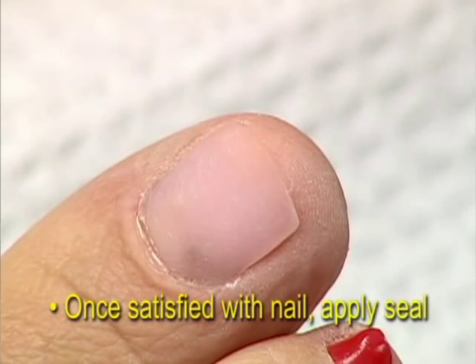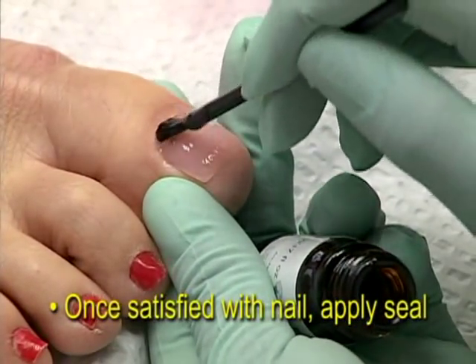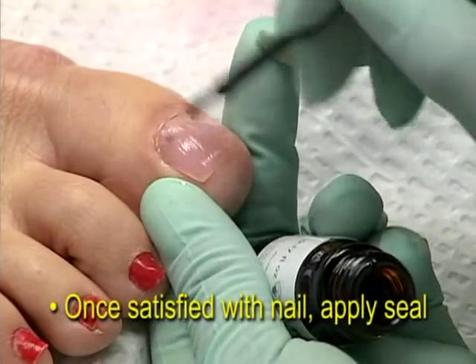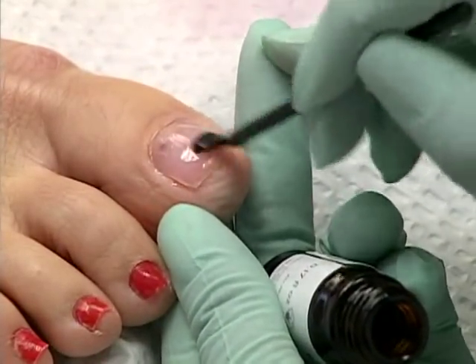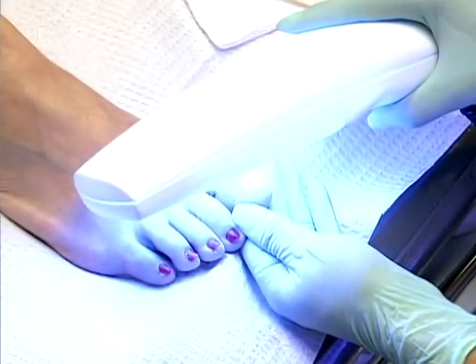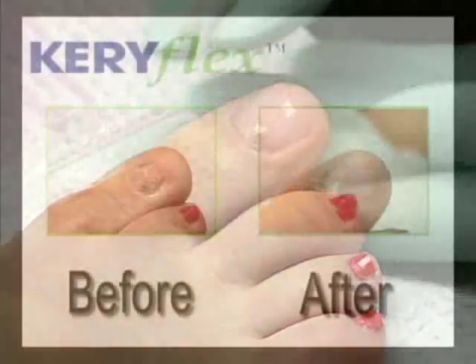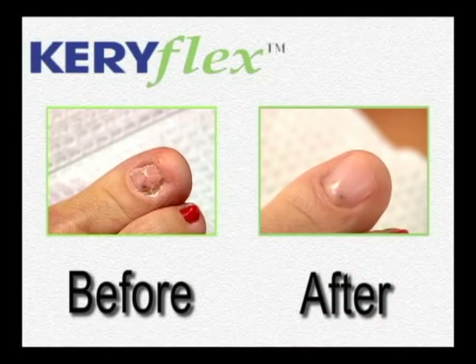If you and the patient are satisfied with the aesthetic result of the Keriflex procedure, the next step is to apply a thin layer of Keriflex seal with a black brush onto the nail. Wipe the resin off of the black brush before applying the seal. After the two-minute cure period, wipe the film away with an alcohol swab and the procedure is finished. Patients may immediately put on their socks and shoes.